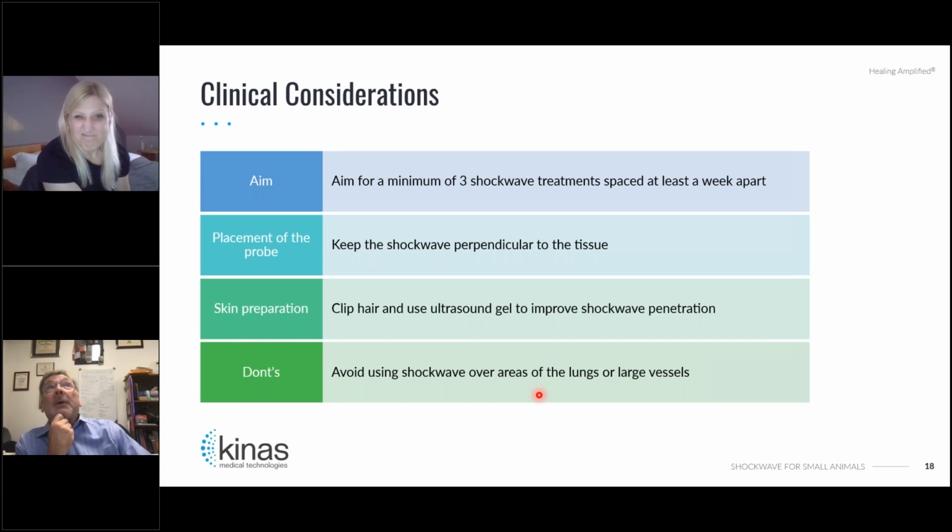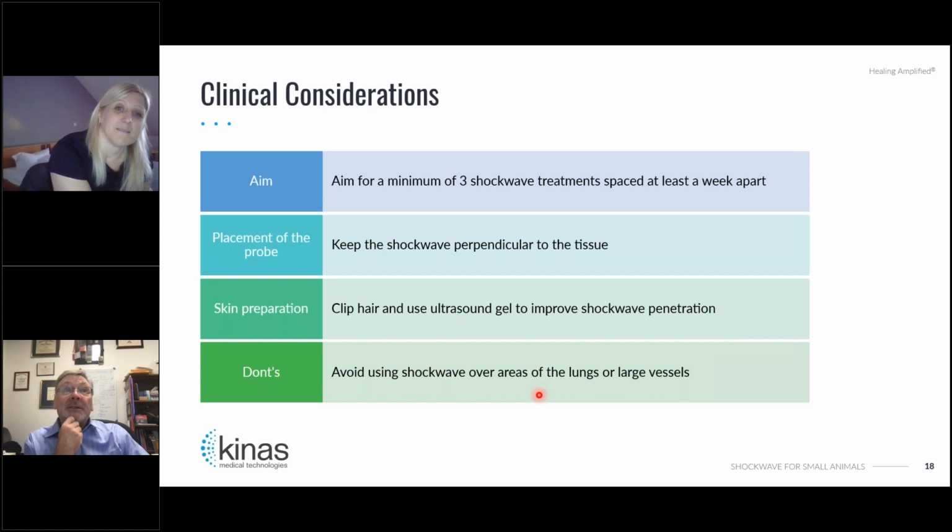Well, I think it also helps to differentiate yourself from other clinics that don't have it. We see a fair number of agility dogs, and some do get a treatment once a month. They'll bring 4 dogs in, and we treat them all, to keep them healthy and well. And the owners, they're the ones seeking this out. I might say the dog looks great, but they're seeking this out, like you say. They want to keep them healthy. That's true. Yeah.